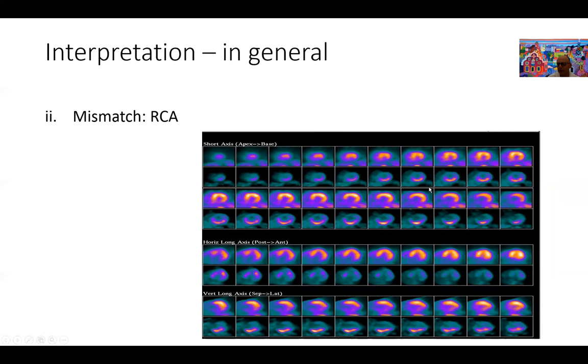Then you go next to the FDG images, and you can see here right away you have this fixed defect on the perfusion images in the inferior inferolateral wall, and that defect fills up with FDG beautifully right here. You can see right away this patient has hibernation of the entire segment that we thought was dead and scarred on the perfusion images. This is what we call a mismatch defect: you have a defect on the rest images that fills up with FDG on the metabolic images.